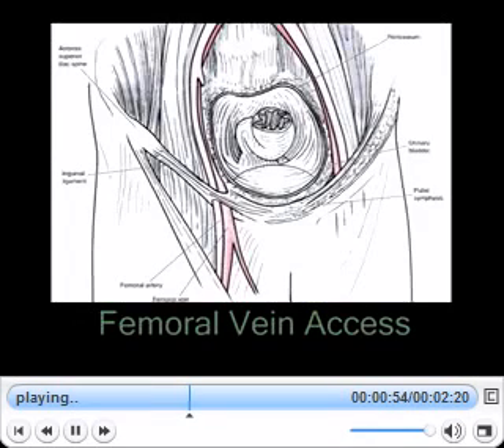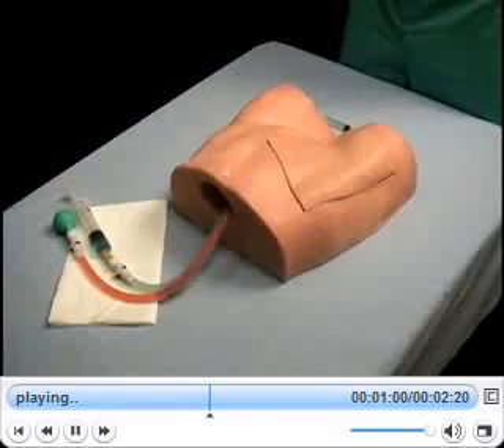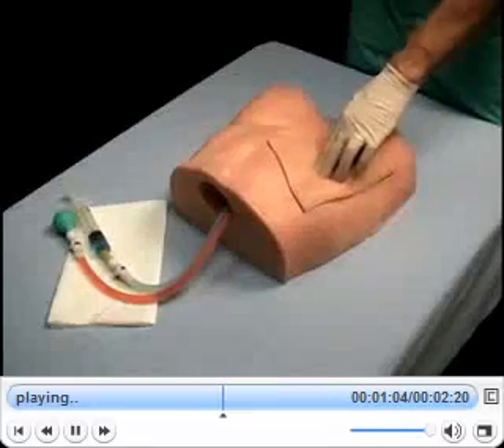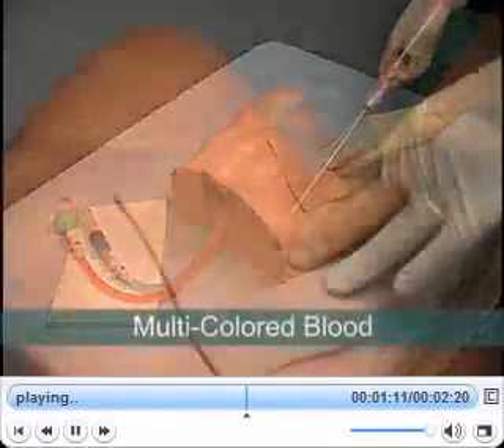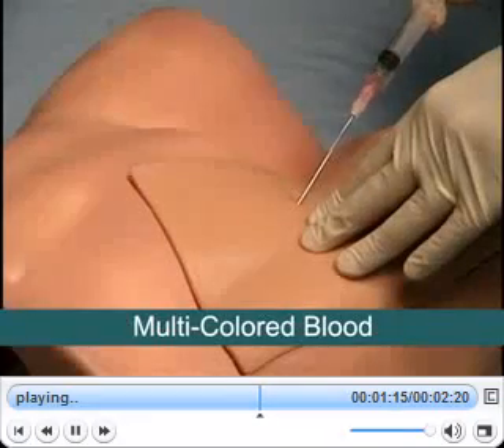Now let's take a closer look at what to expect when performing the procedure. When using landmarks of the anterior superior iliac spine and the pubic symphysis, you will be able to find the femoral artery and the inguinal ligament. You will see a blue flashback of fluid if you hit the vein and red if you hit the artery.